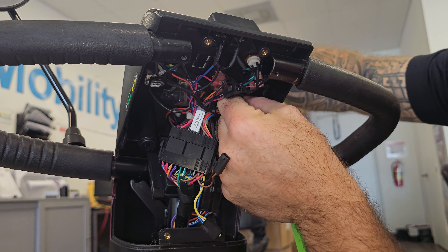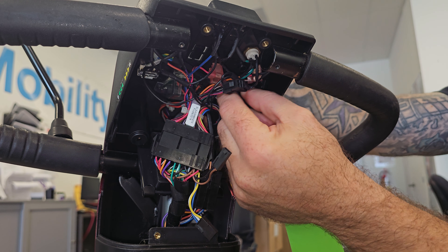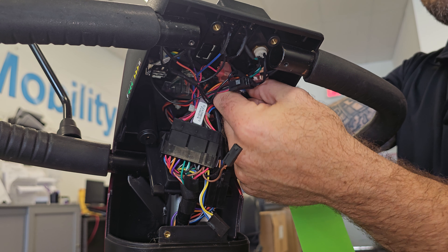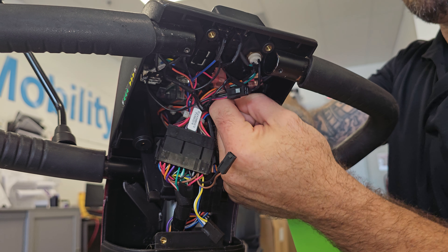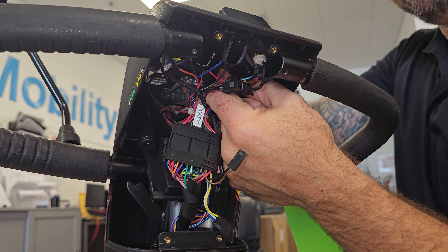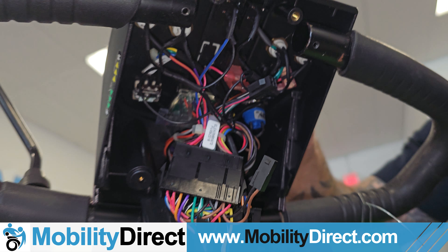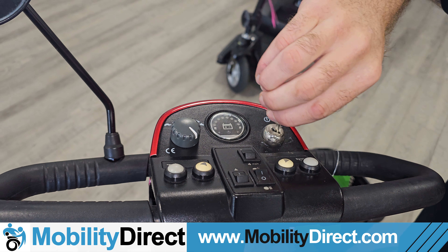You just tighten it up — finger tight should be good. You might want to disconnect the battery from the scooter first; I left it on just for video purposes since I'm not putting anything metal in there and don't intend on shorting anything out. I'm just going to use my fingers, squeeze on tight to that nut, tighten it up as much as I can, and as you can see it's nice and snug again.